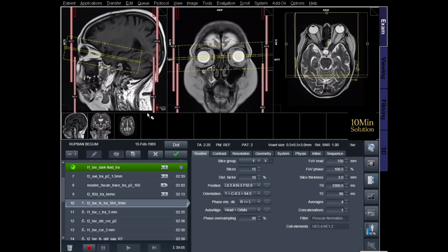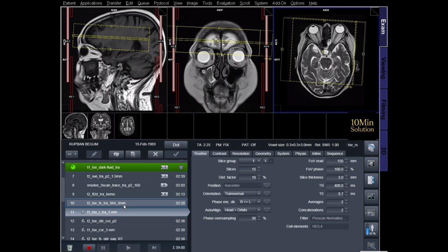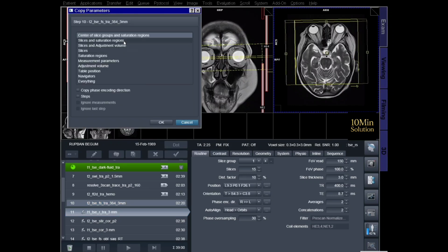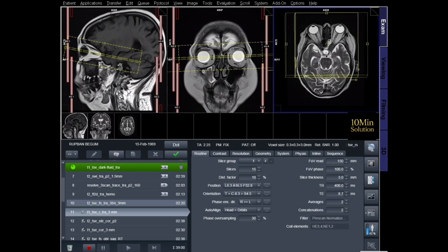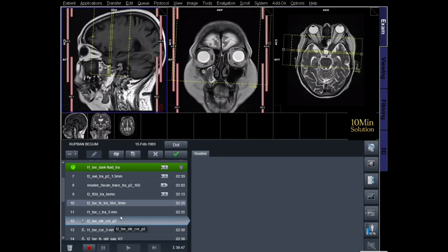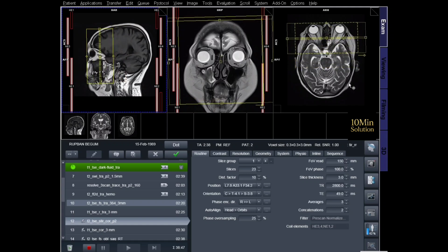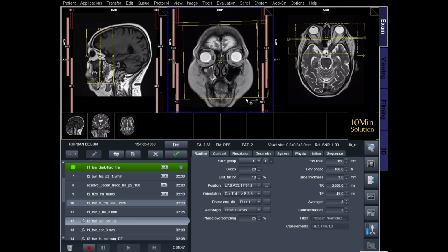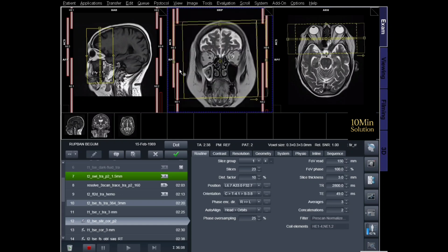Patient preparation. Before performing the MRI scan, proper patient screening is essential. The patient must be asked about any metallic implants, such as cardiac pacemaker, aneurysm clips, cochlear implants, or metallic foreign bodies, because these may be contraindications for MRI. All metallic objects, including jewelry, watches, hairpins, and belts, should be removed before entering the MRI room.